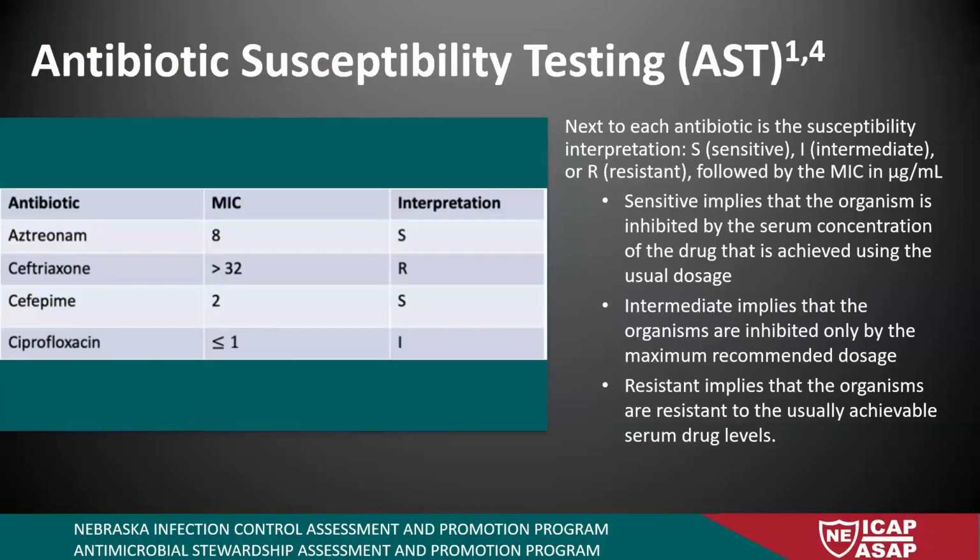So CLSI, like I said, they're the ones who develop these standards for susceptibility testing. The standards are usually updated annually, and it's a group of many different parties. There's physicians, microbiologists, pharmacists, and some people from the pharmaceutical industry who sit on this board. And here's an example of something that they updated recently, in March of 2025: aminoglycoside MIC breakpoints.